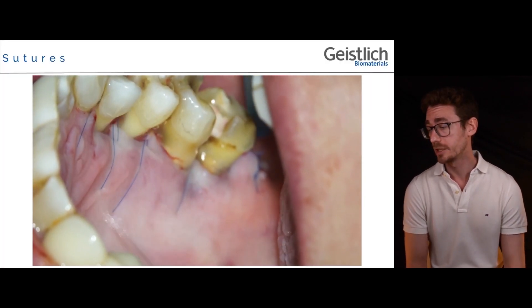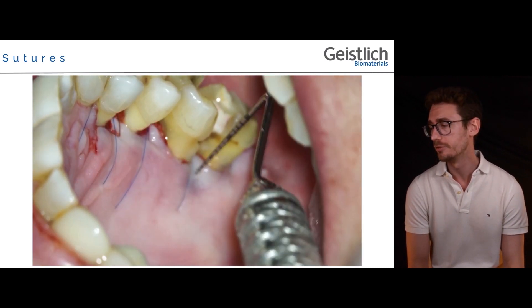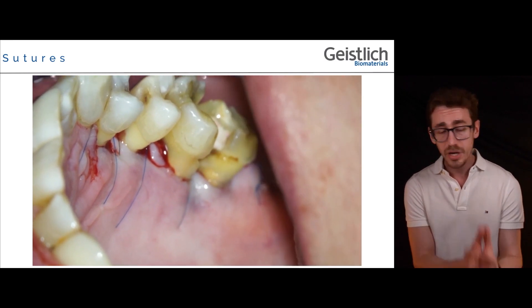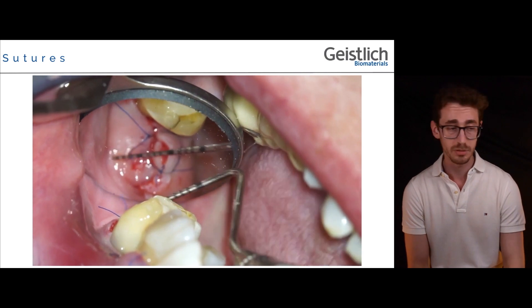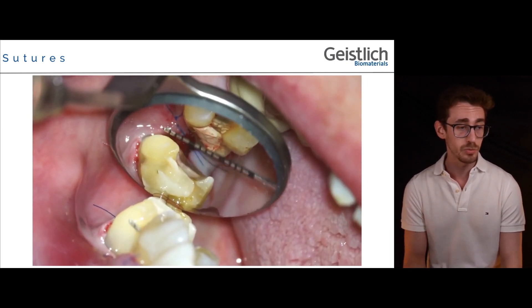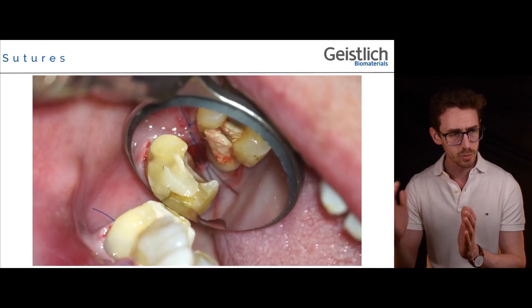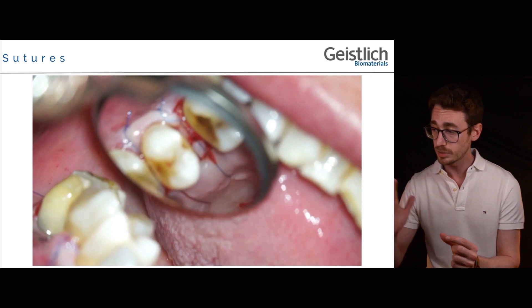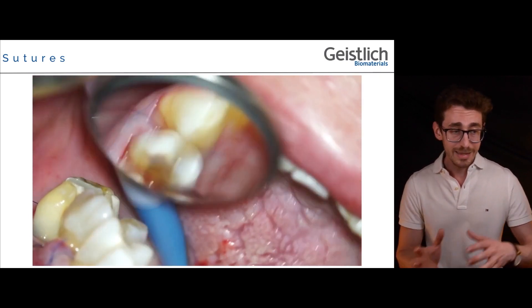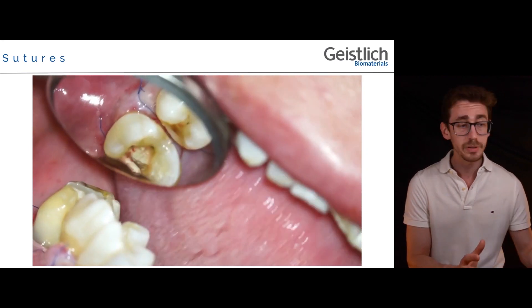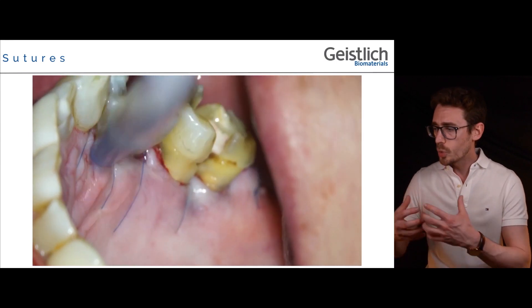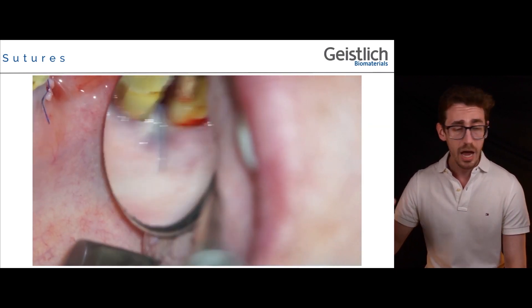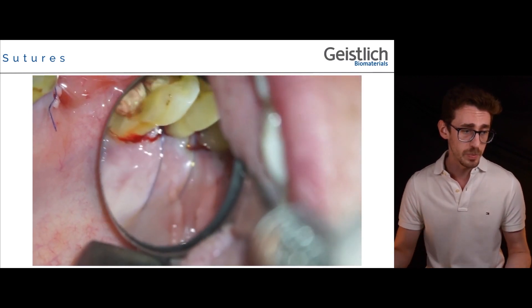We move to the suture line, in which a series of modified internal vertical mattress sutures has been performed interproximally. This suture type provides a good combination of a compressive effect on the palatal aspect and tight adaptation of the tissues interproximally. The distal wedge has been closed with simple interrupted sutures, and the complete area of the bone ramp as well as the area where the bone reconstructive procedure was performed are fully covered by the surgical papilla of the palatal flap. Good adaptation of the tissues around the emergence profile of the roots is achieved, with adequate restorative space restored for the supracrestal soft tissues.